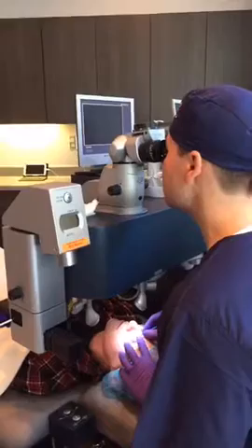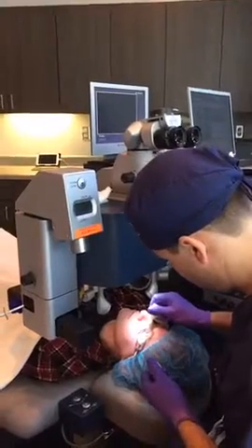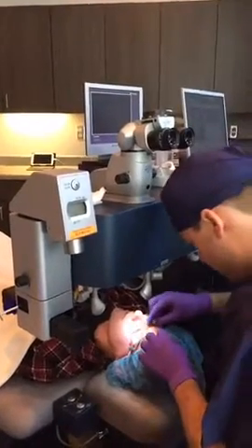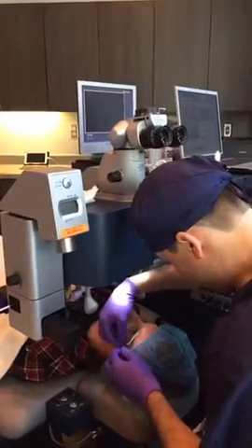Okay, everything looks absolutely perfect. A couple more drops here. And that is it. We are finished with the laser treatment. Awesome. Thank you. Remove this from your eye.